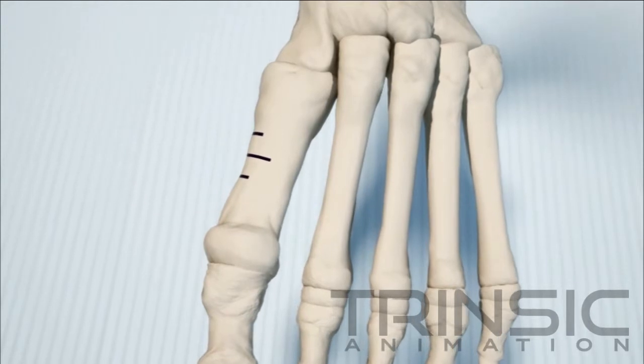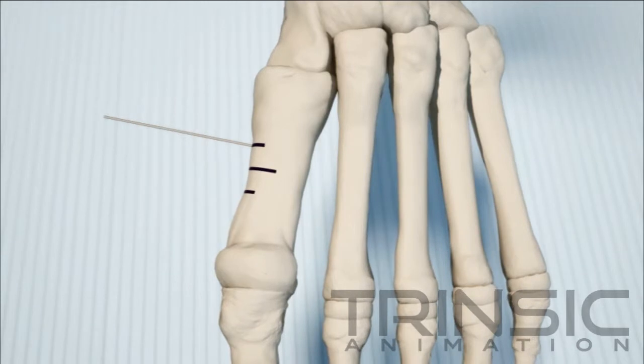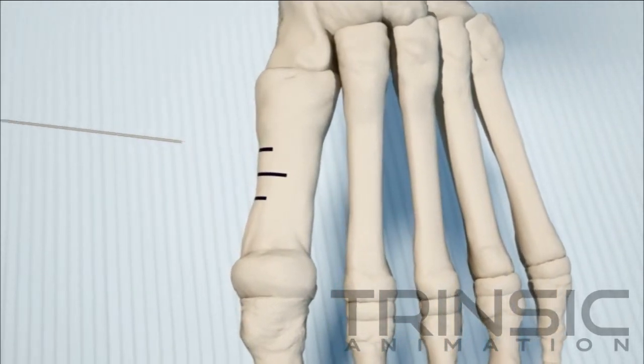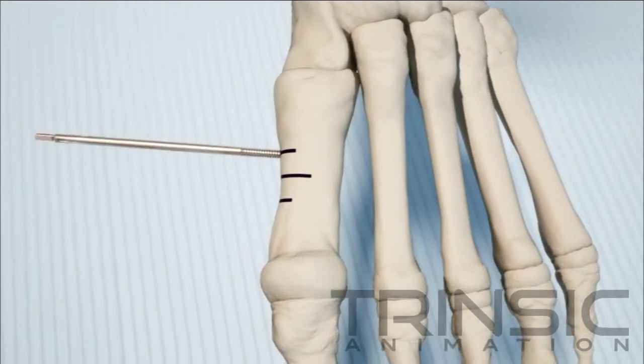Use a 1.6 mm K wire where the first proximal pin will be. Position the wire perpendicular to the bone surface. The wire is used to puncture the cortex. Remove the wire and insert the first half-pin.